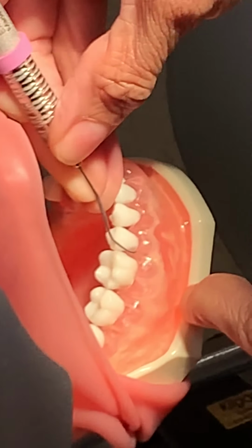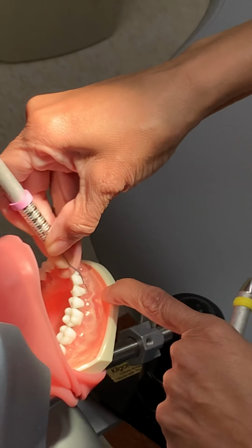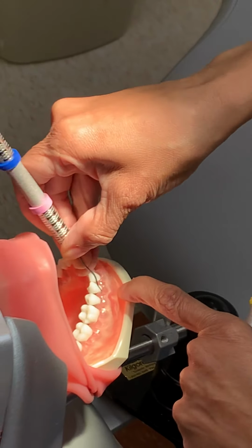Distal line angle. Now that I'm on this premolar, I'm kind of fulcrum on the incisal of the anterior, because you know we talked about fulcrum being 1 to 4 teeth away, and we talked about the length of the fingers. So because I have shorter fingers, I'm going to have to be a little bit closer to the tooth. So distal line angle, and I want you to stay above. You can go subgingival, but I want you to kind of stay right at the gum line so we can see how your tip is adapted.